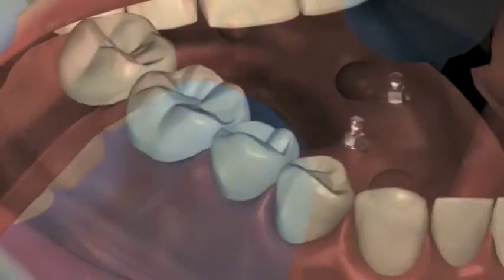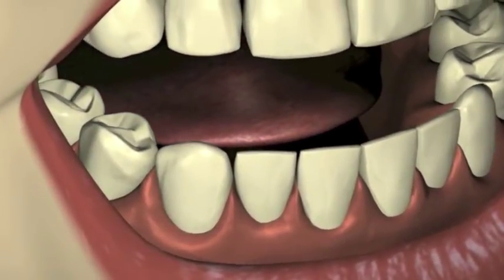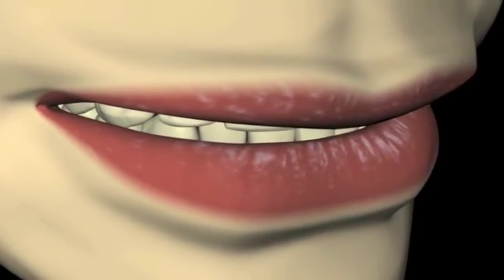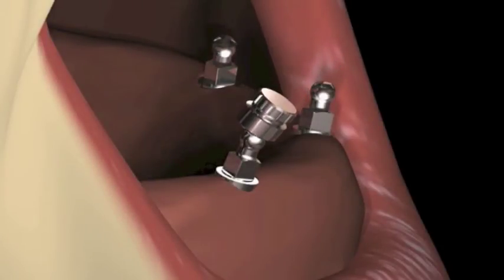Try the denture in the patient's mouth and verify that the appliance is seated passively while in maximum intercuspation. The O-balls should not touch any part of the denture. Snap a retentive housing assembly over each O-ball.